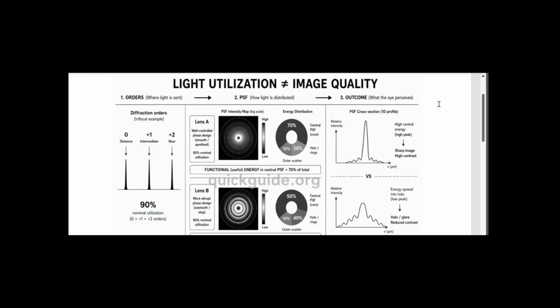While halos, glares, and dysphotopsia with diffractive IOLs can be multifactorial, and could be related to patient selection, here I am going to concentrate only on the IOL optics and explain why very high light utilization may not always lead to better image quality.